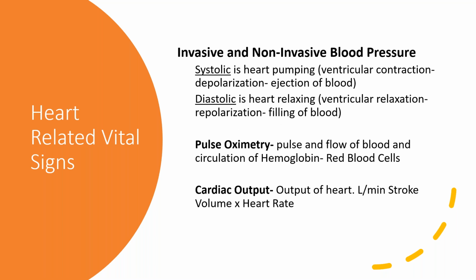And I've seen that even in nursing units. I hate to badmouth nurses with the nurse in the room, but I've seen them reversed before, especially the black and the red. Seems like that's an easy one to reverse.